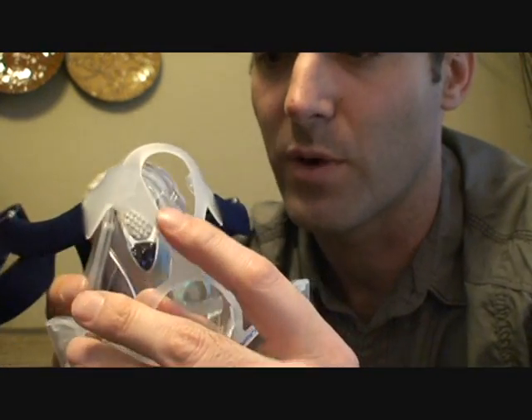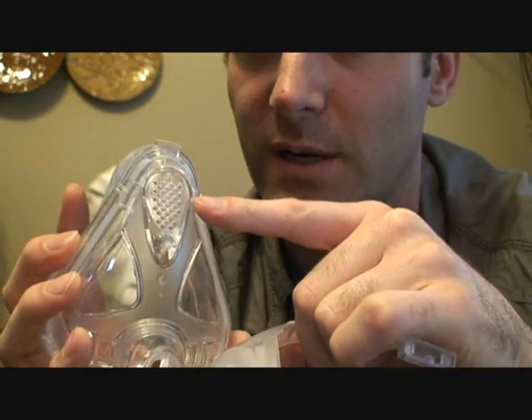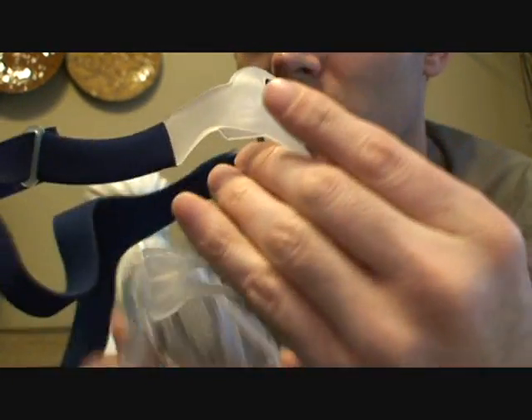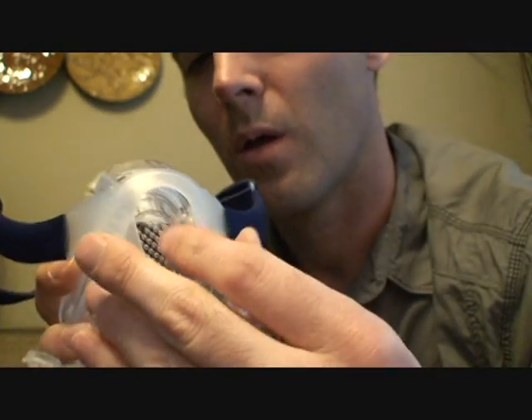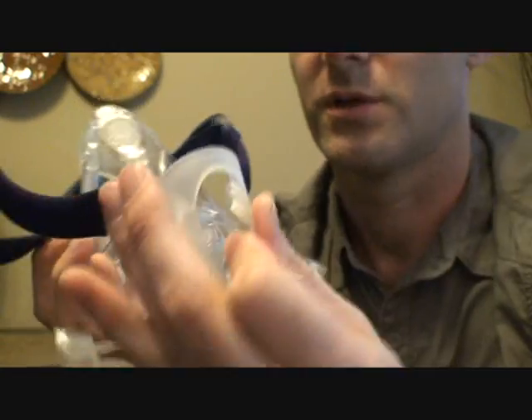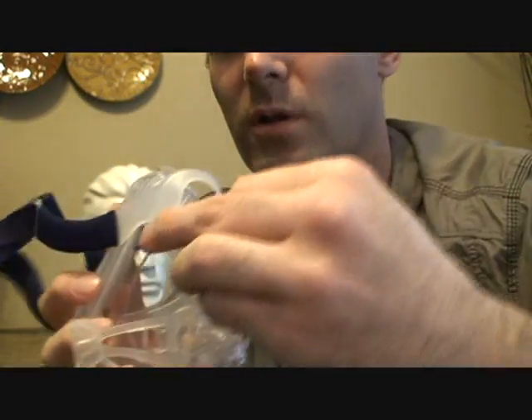There are some tabs in here that line up with tabs on the frame. Before pushing those in, make sure you put the headgear strap back through the hole — otherwise you're going to have a heck of a time, like someone just did just now.